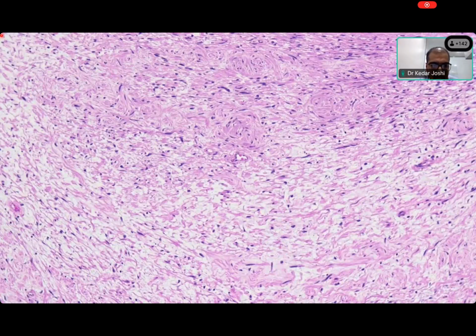Cells are spindle cells, ma'am. They are elongated in shape, having an elongated nucleus, and the pattern appears to be haphazard. I don't think so. No, there are fascicles. They may be interrupted fascicles and rather poor fascicles. You can see that. But what do you notice about these spindle cells, Kedar? That's why it's important to make observations. Elsa, you want to help?